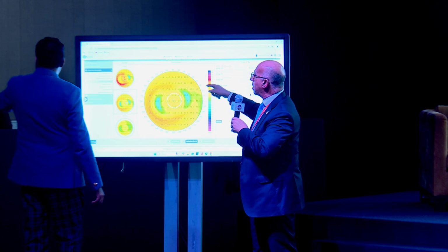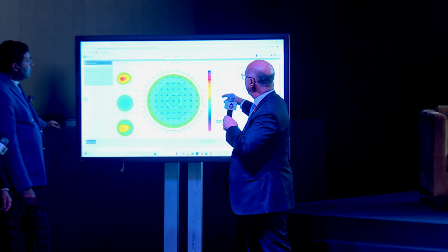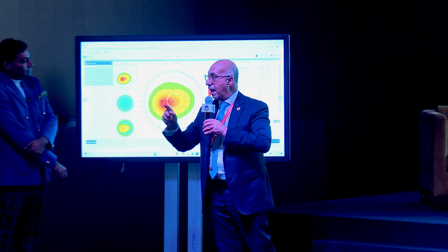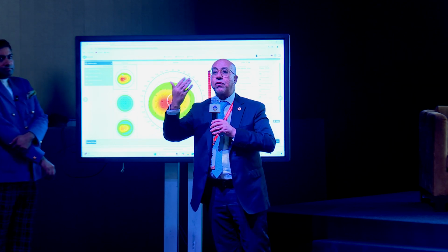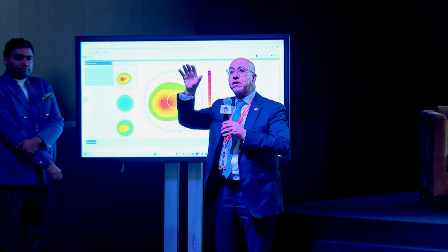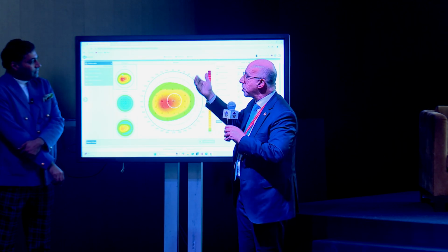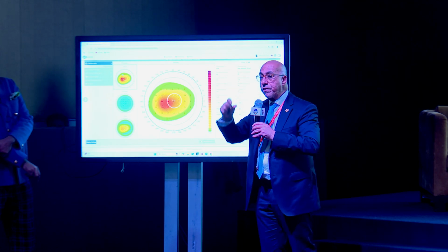If you go back to the total planning, this constant gradient is only 11 diopters per millimeter. And I would ask Mr. Giuseppe to tell us about the other machine. What is the gradient for the machine that makes a fixed 6 millimeter optical zone by 8 millimeter transition? It would go to 45 or maybe 50 diopters per millimeter. So in this lies everything, the secret of the recipe.